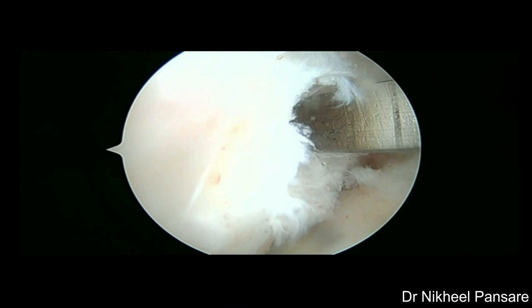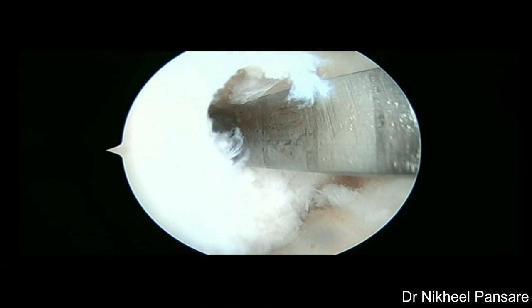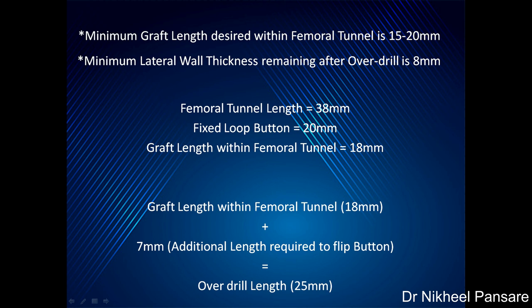Femoral tunnel length is measured — here it is 38 mm, good enough. Minimum graft length desired within the femoral tunnel is 15 to 20 mm, and minimum lateral cortical thickness remaining after over-drill should be 8 mm. Here the femoral tunnel length is 38 mm; we took a fixed loop button of 20 mm, so the graft length within the femoral tunnel would be 18 mm. For this 18 mm of graft within the femoral tunnel, we need an additional 7 mm of length to flip the button, so the over-drill length would be 25 mm. Calculation for a flexible loop is different and easier — we will discuss about it in some other video.